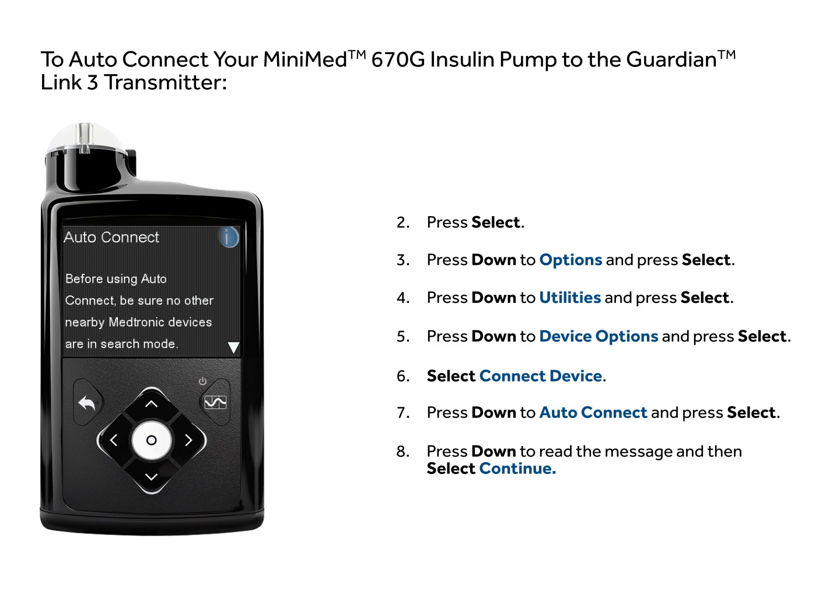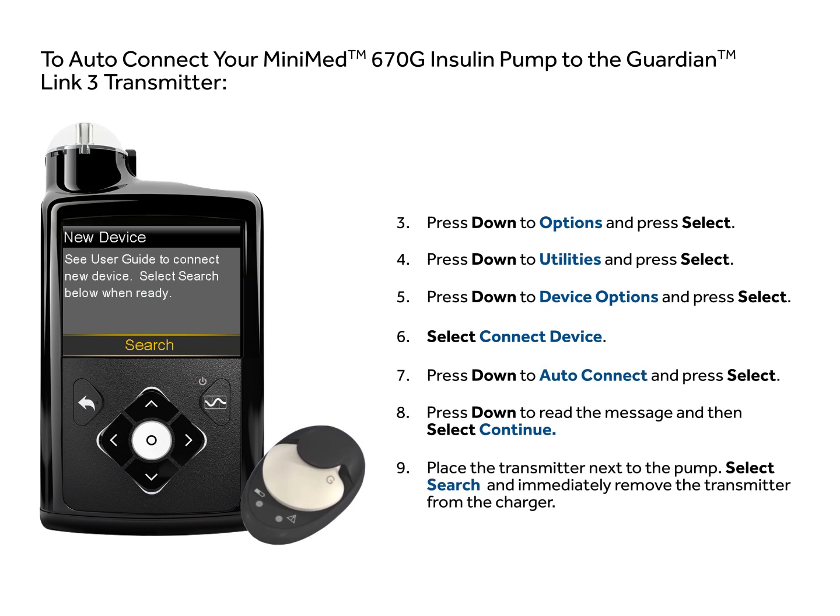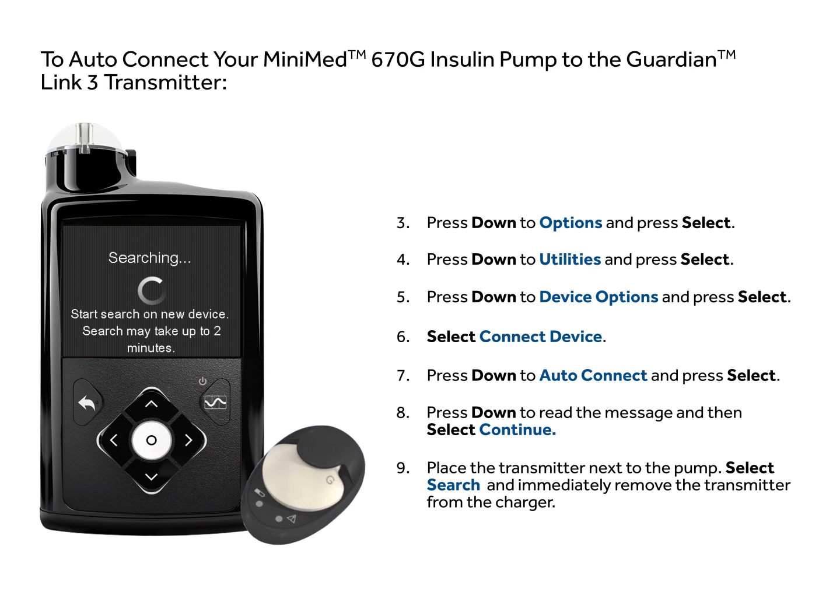Press Down to read the message, then select Continue. Place the transmitter, still attached to the charger, next to the pump. Select Search on the pump and immediately remove the transmitter from the charger.